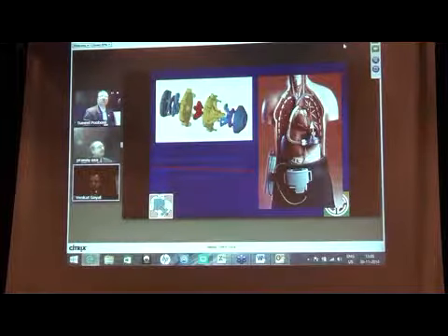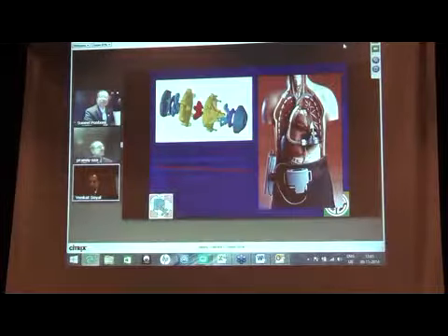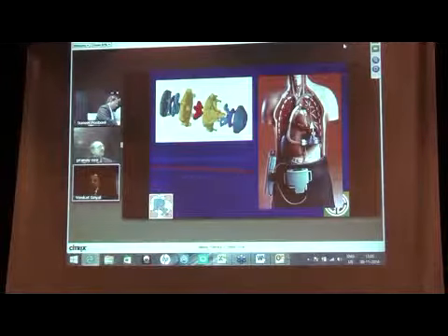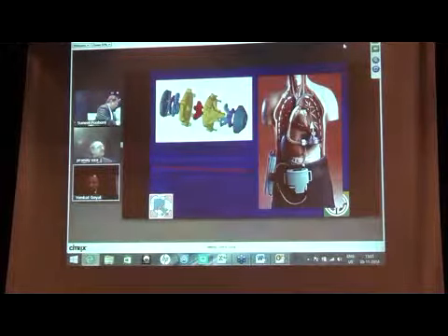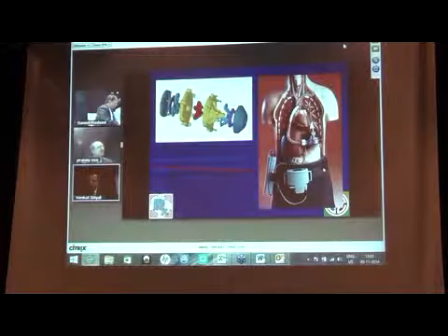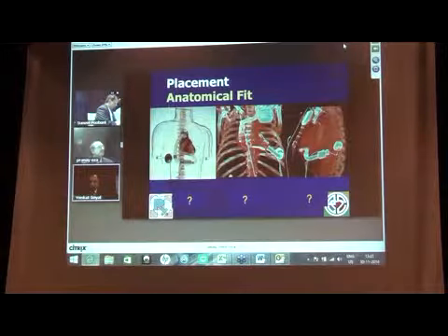You see the heart, the machine is put under the heart in the abdominal cavity. It is taking the blood from the LV apex here and is returning the blood via a tube, which goes back to the aorta. That is how it is bypassing this. And the entire machinery is connected to a cable. The cable comes out percutaneously and is attached to the battery, and the battery to the console. So the patient moves around with an abdominal belt where the battery and these things are connected. But it is much better than the big console that you see. These are various examples of how it is in there.